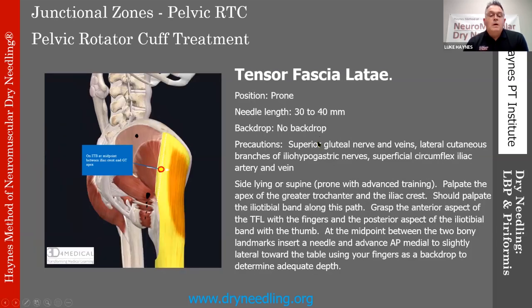For tensor fascia lata, I'm going to have a very similar location that I'm looking for as far as needling. However, with TFL, we have the IT band in this area right here, and that is the piece that runs distally to Gerdy's tubercle. However, the TFL itself sits a little bit more anterior, so instead of a lateral to medial approach, we're going to go from posterior to anterior. So they're going to be lying prone, and we're going to needle down towards the table. We'll use our fingers on the anterior aspect to appreciate our depth so that we don't run the needle through the skin out the other side.